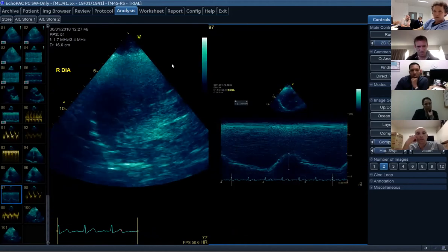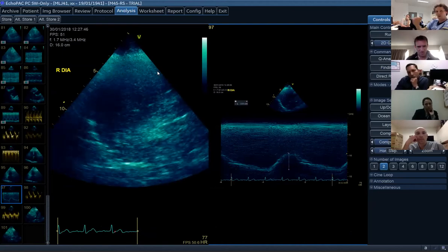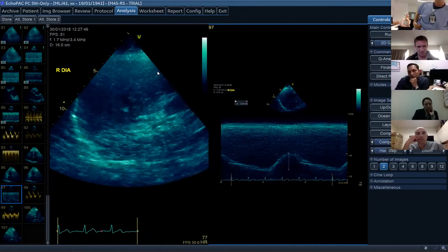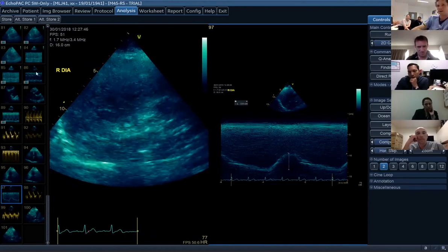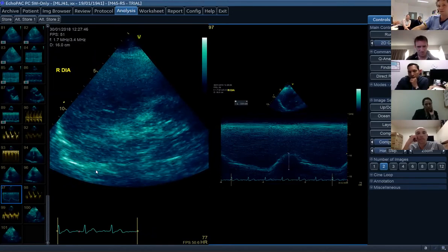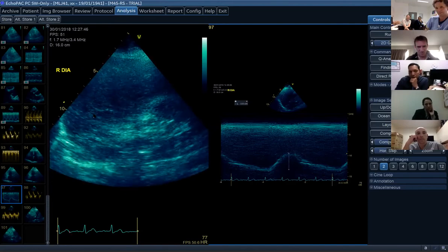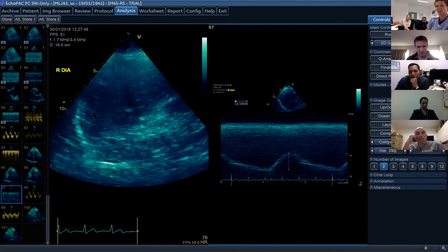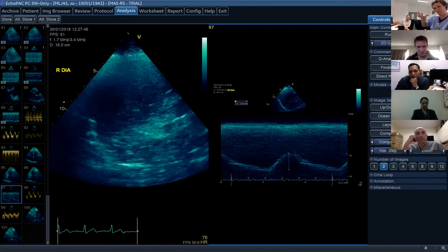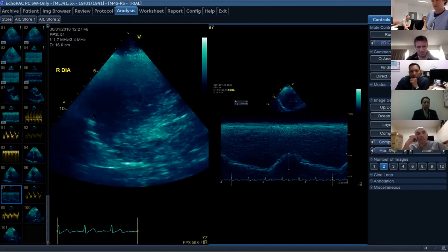Okay, so on lung ultrasound, if you use your echo probe and go underneath the rib cage on the right, pointing up towards the chest, at the mid-axillary line, you can see the liver here with the diaphragm as that bright white line. This is on the right side. This is a normal diaphragm moving as someone breathes in and out, because when you breathe in, the diaphragm flattens out and pushes down the liver.